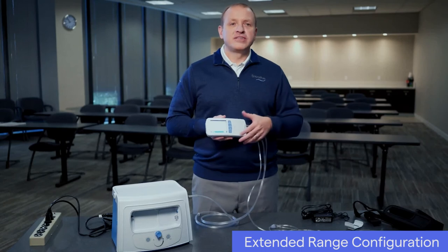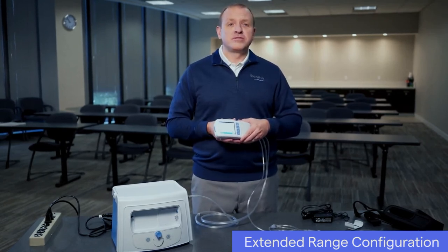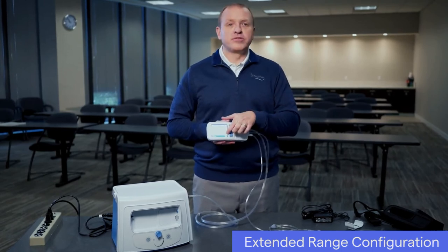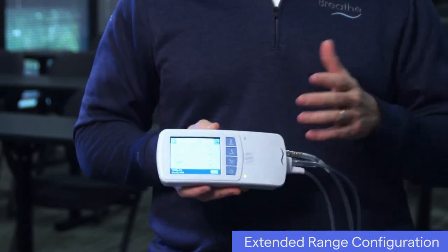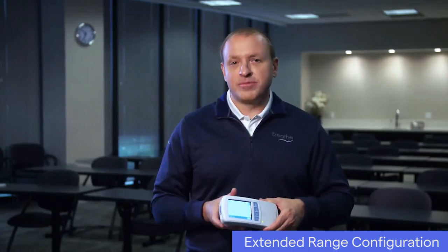The ventilator has an internal battery that is separate from the compressor. When the ventilator is powered on, you can check the battery level at the bottom right corner of the screen. When the ventilator is charging, the ventilator battery charge icon will display either the charging icon or the icon for 100% charged. We'll cover charging the ventilator in the next chapter.